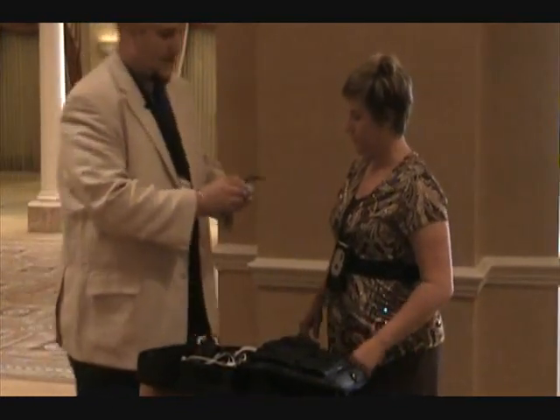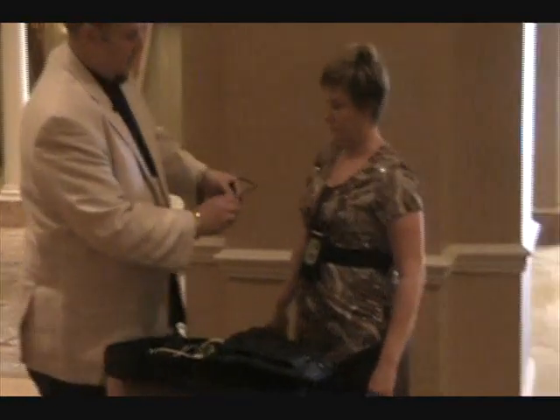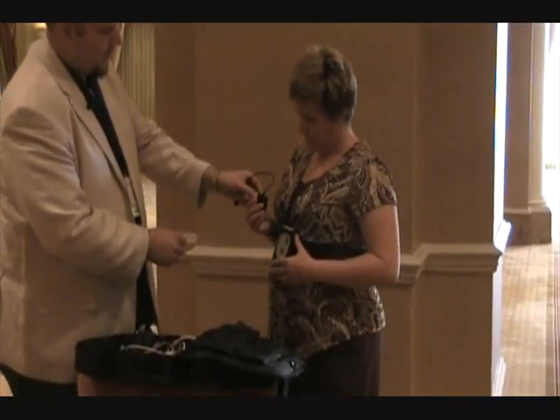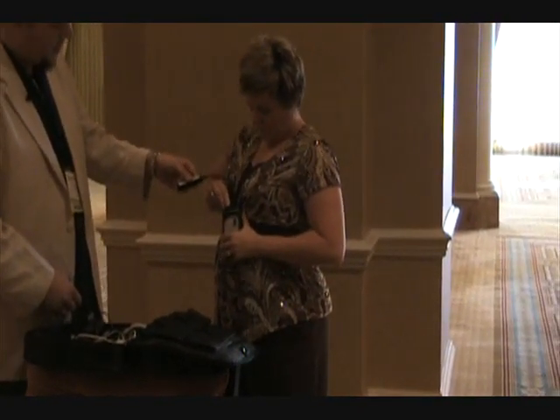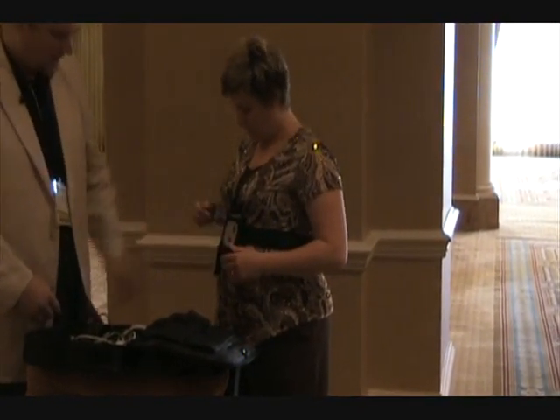The proxy, which is where all the things plug into, is going to plug square into the top here. It just fits into that open port on the top — find where it goes and push all the way down real firm. Very good.